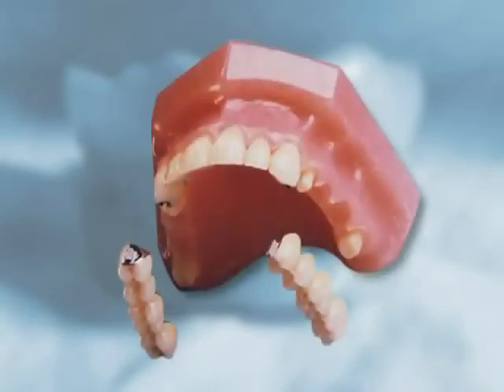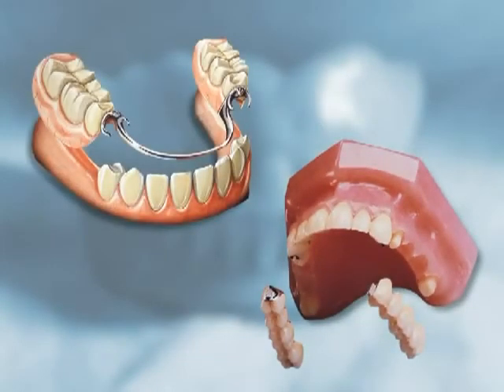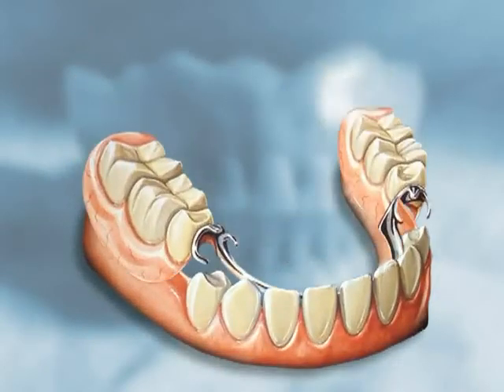However, precision attachments are more expensive than metal clasps, so most partial dentures still use clasps for retention.